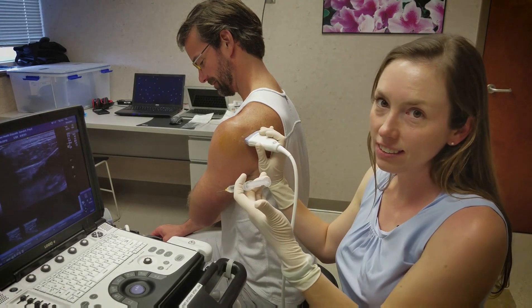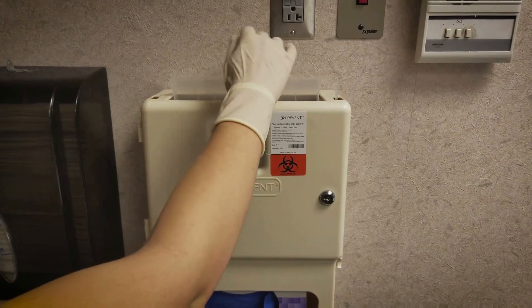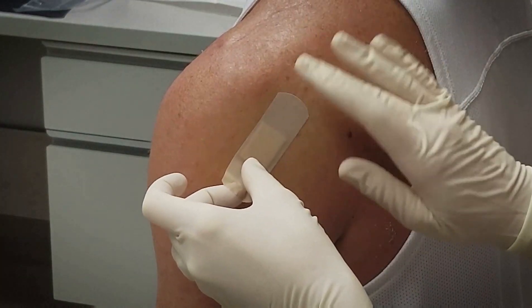Withdraw the needle, dispose of it properly, and cover the area with a clean bandage.